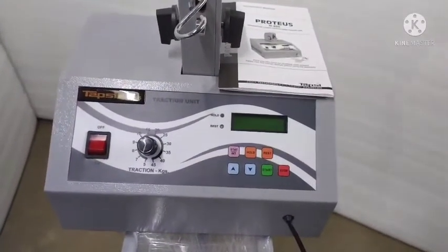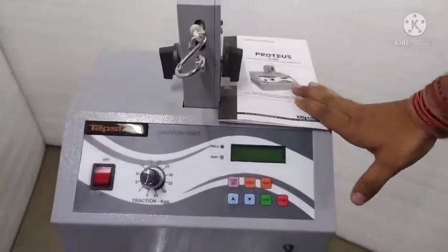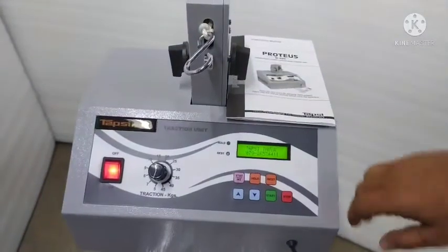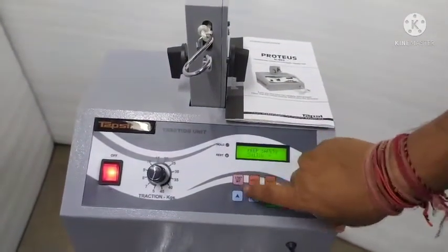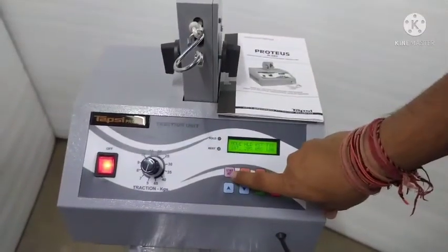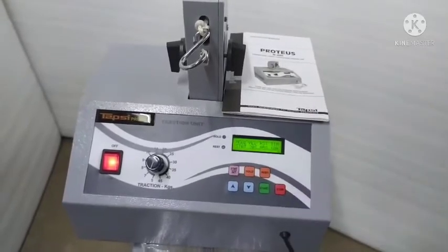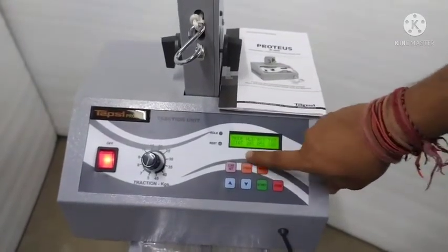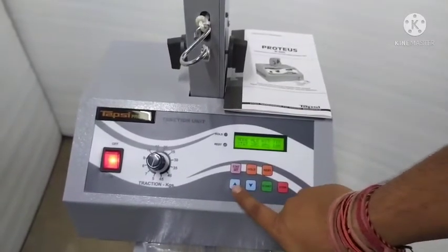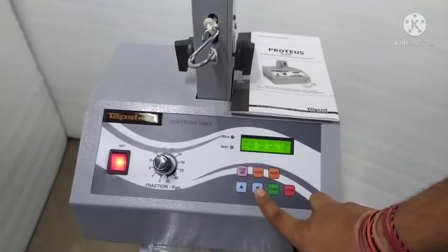In this video, we are going to see how to apply lumbar traction from this unit. First of all, we start the machine and we select static mode or intermittent mode. For this video, we select static mode. In the static mode, hold key and rest key are not useful. These both are timer keys. From this we can increase time, and from this we can decrease the time.